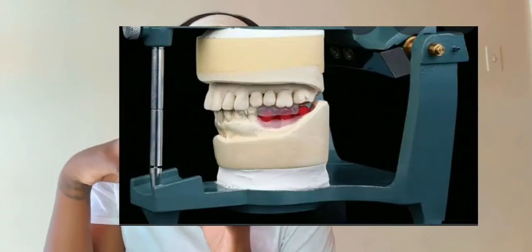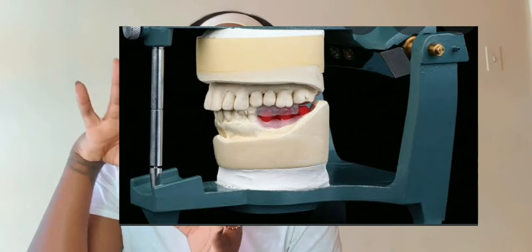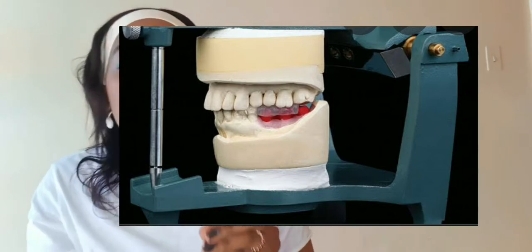So at the lab, basically with our wax blocks, they're going to put them on our articulator to keep the patient's mouth and models in position, and then from there, based on your dentist's measurements and your dentist's tooth form and shade, the lab will choose the appropriate teeth to place onto the wax blocks that you measured at the third appointment. So what comes back at the fourth appointment would be a denture but in wax. We haven't acrylized it, it's not the final product.